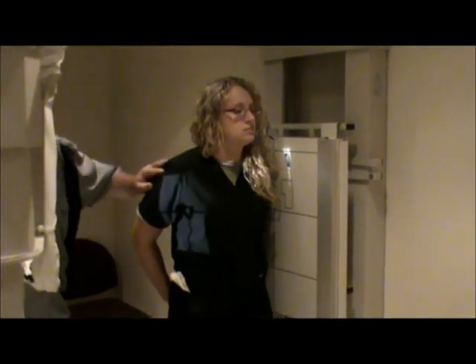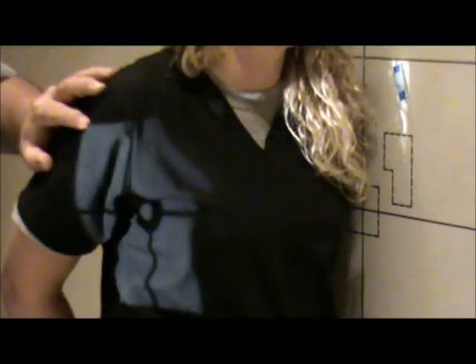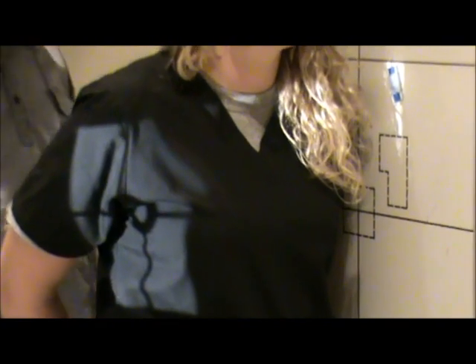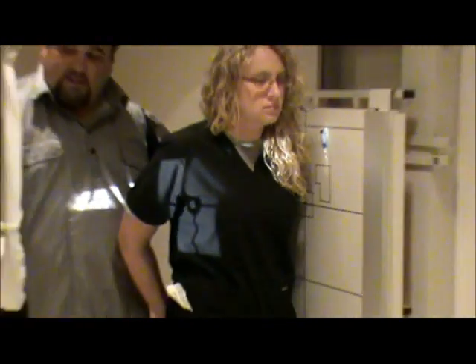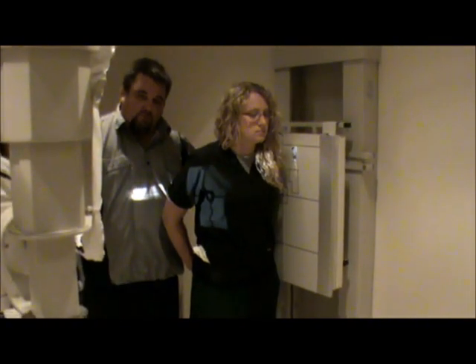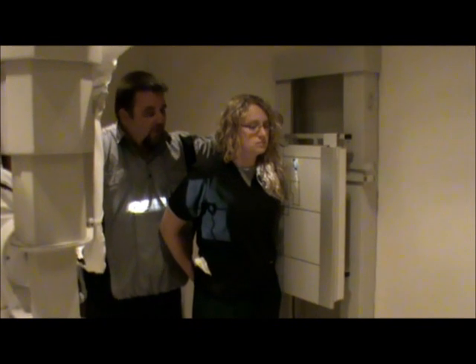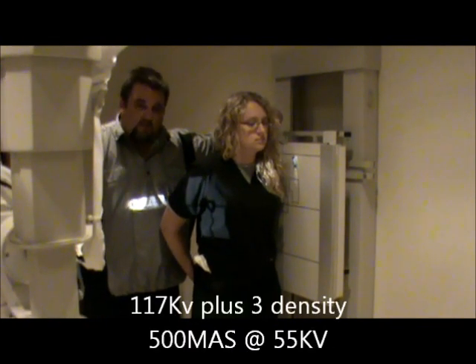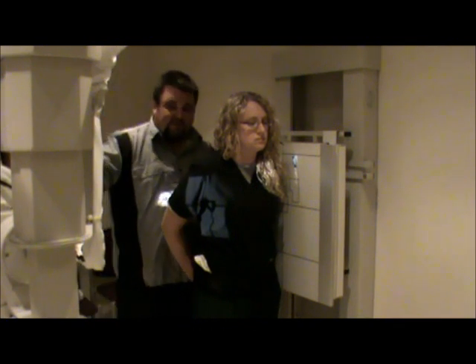For collimation, I want to be to the top of the IR and make sure we're including the entire sternum. For the technical factors, there are two techniques: you can do 117 kV plus three center cell, or you can use 500 mAs at 55 kV.